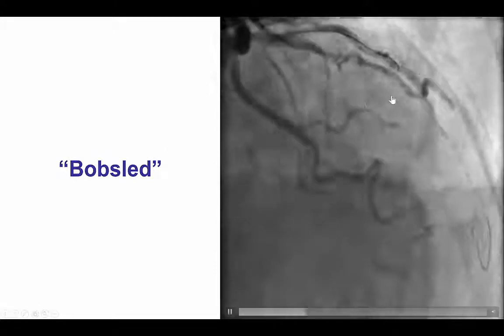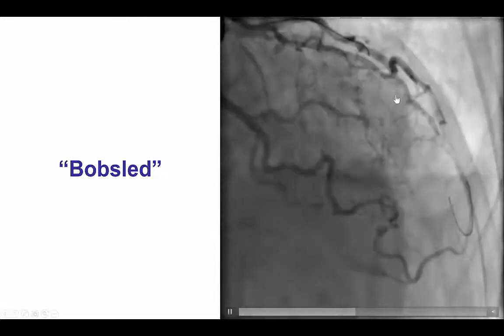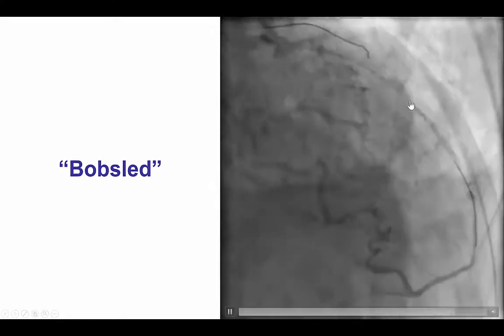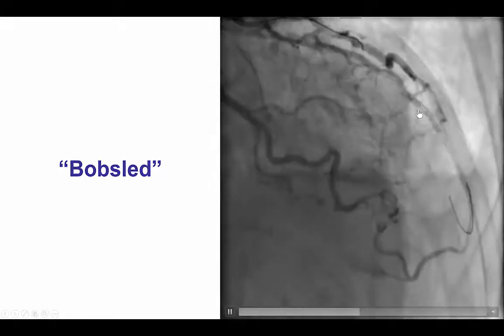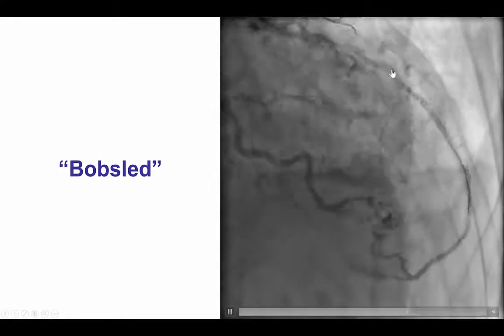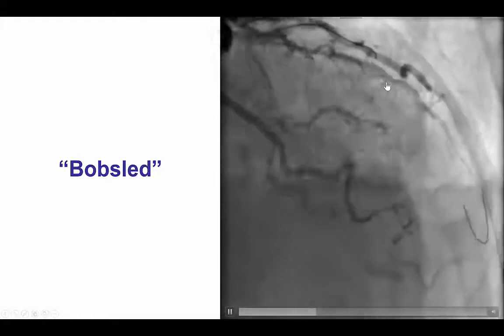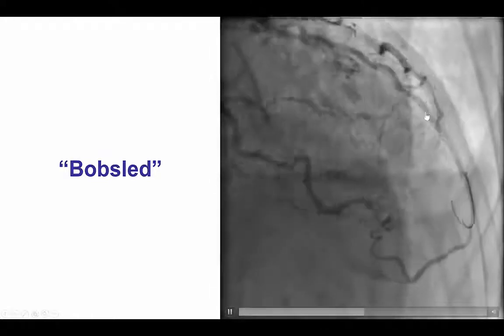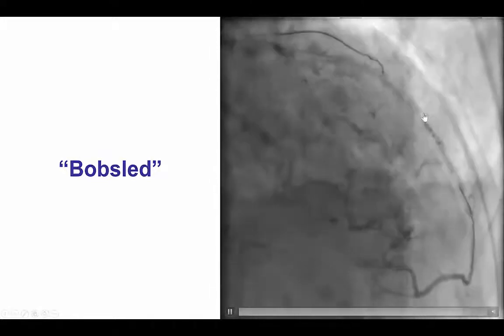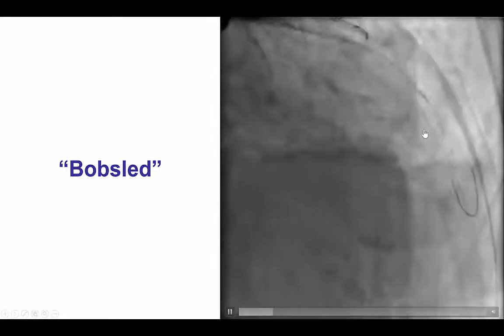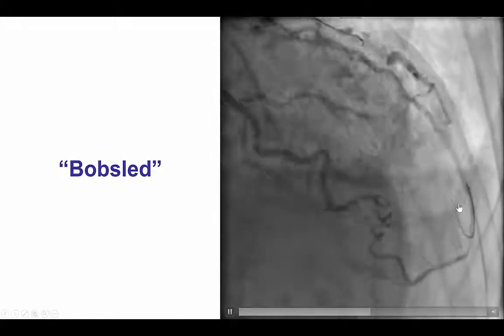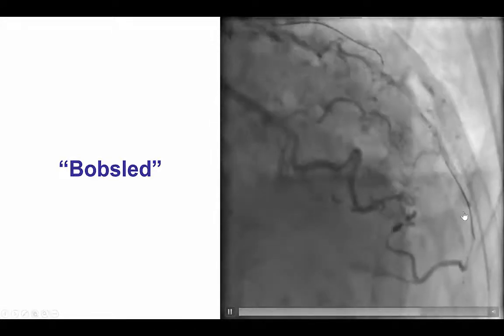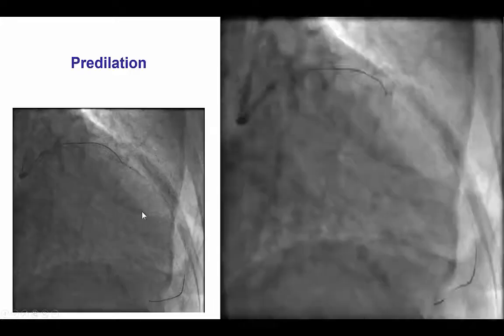The bobsled maneuver is not the preferred one since we may lose more branches the further down we re-enter into the vessel. We tried several times more proximally and were unable to enter. We therefore went further down and this time with the double blind stick and swap technique we were able to advance the Pilot 200 guidewire into the distal true lumen.